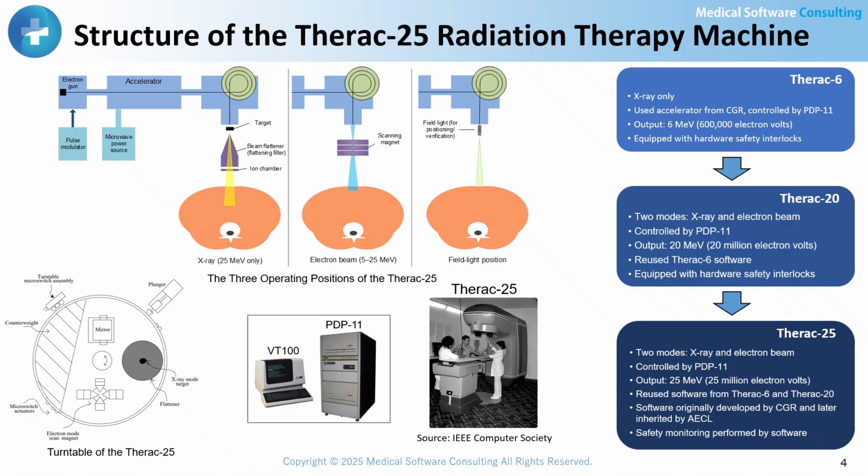The Therac series was operated by a Digital Equipment Corporation PDP-11, a widely adopted 16-bit computer in the 1970s and 1980s, known for being compact, cost-effective, and powerful for its time. This represented one of the earliest cases of a general-purpose computer being used to control a medical device. The PDP-11's console terminal was the VT100, a monochrome display with a keyboard and 80 by 24 characters.